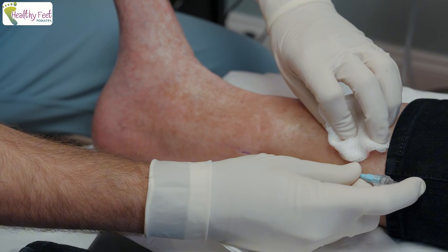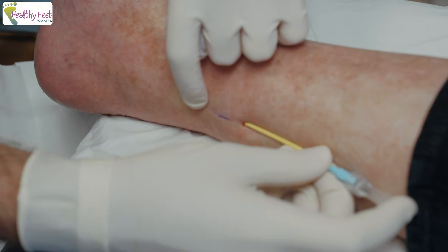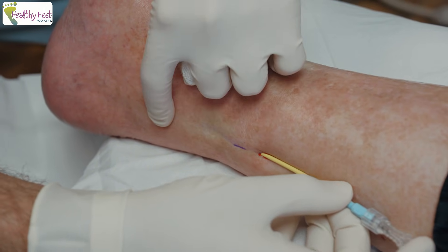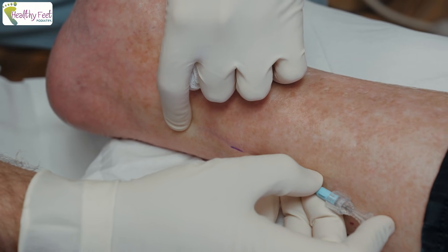I'm inserting the introducer here — this is the cannulated device that we use to see where to pass the lead. You doing okay? This is the part where you might feel some pressure behind your ankle.